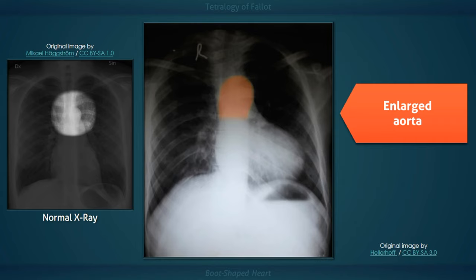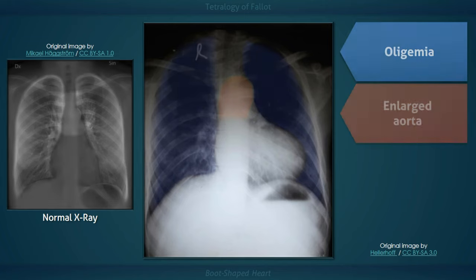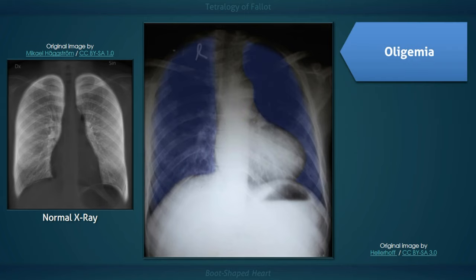The fourth defect is an overriding aorta, which along with pulmonic stenosis and a VSD facilitates the shunting of blood away from the pulmonary system. This results in a large aorta — which in a significant proportion of patients is right-sided — and decreased pulmonary vascularity, visualized on x-ray as diminished lung markings, that is, increased blackness of the lung fields.